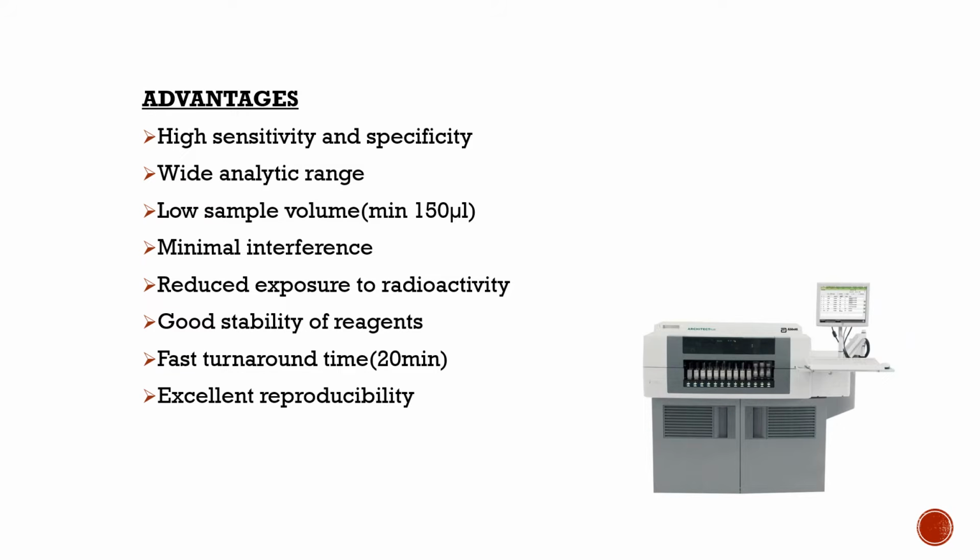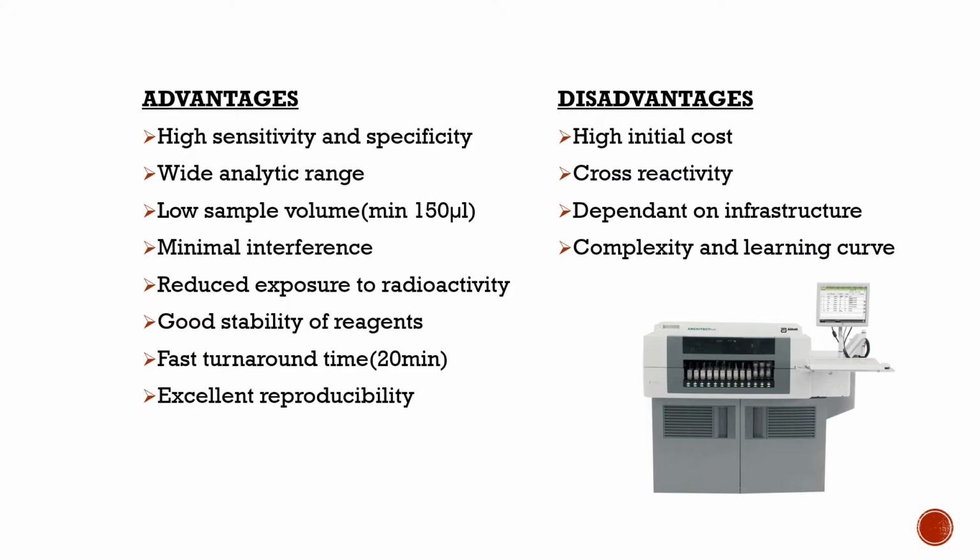Also, any machine error can be detected remotely by the company personnel from their location itself. Coming to the disadvantages: high initial cost, cross reactivity, and the installation is dependent on the infrastructure of the institution, and also there is a learning curve.